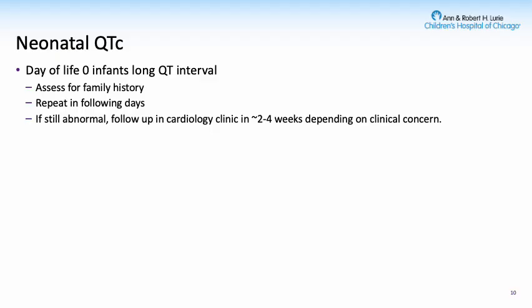And if that ECG in the following or subsequent days is still abnormal, then they can follow up in cardiology in 2 to 4 weeks, depending on your clinical concern. And we, as electrophysiologists, are always happy to lay our eyes on those ECGs and help you talk through those questions. But a lot of babies who have abnormal ECGs on day of life 0, by day of life 2 or 3, the QTC will look fairly normal.